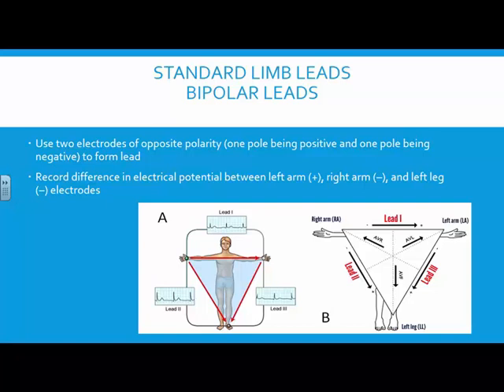So one of the things that you're going to understand as we move forward is that a lot of times we have poor lead placement, and that leads to poor rhythm generation, or poor monitoring.